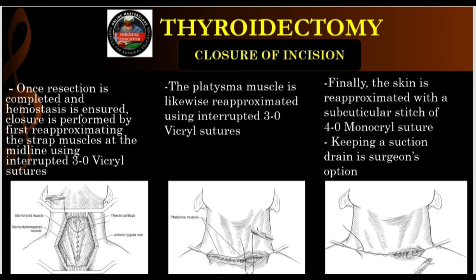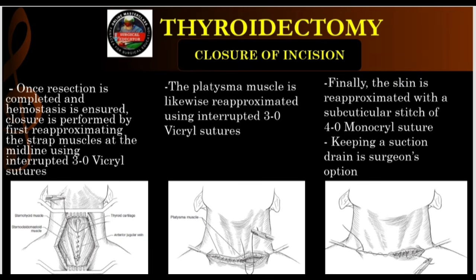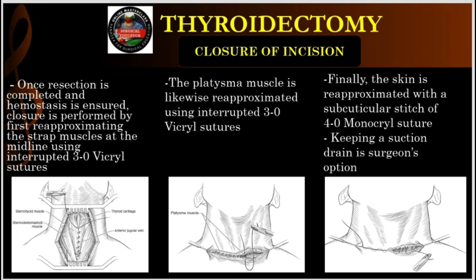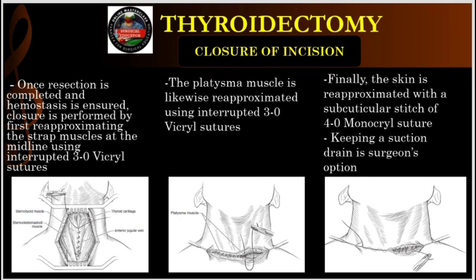Right. While the patient is paralyzed, the anesthesiologist squeezes the bag, forcing a sustained, high-pressure breath into the lungs. Mimicking a massive cough. Venous pressure in the neck skyrockets, and you watch the empty thyroid bed. If there's a microscopic vein you missed or a weak clot, the pressure spike blows it right open. It starts hemorrhaging instantly in front of your eyes, which is exactly what you want. You find it, fix it, and test again. You only close when a massive Valsalva remains perfectly dry.